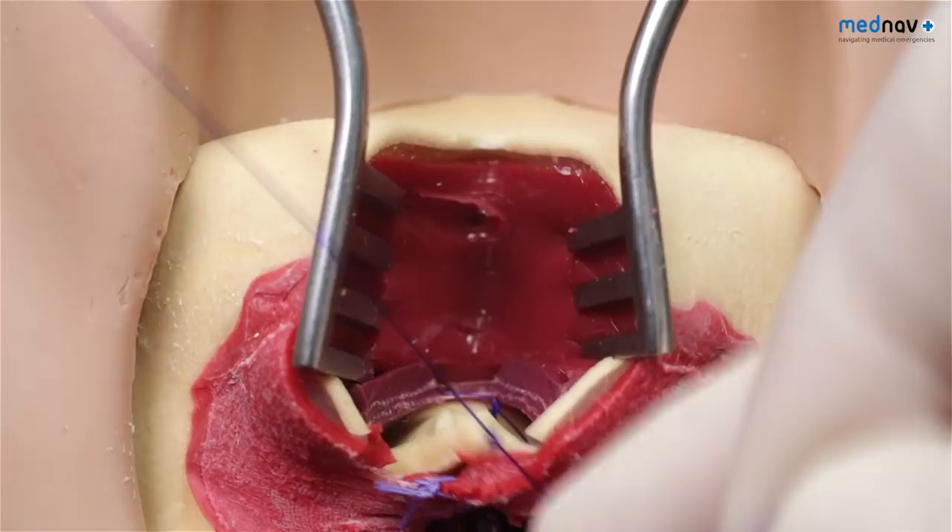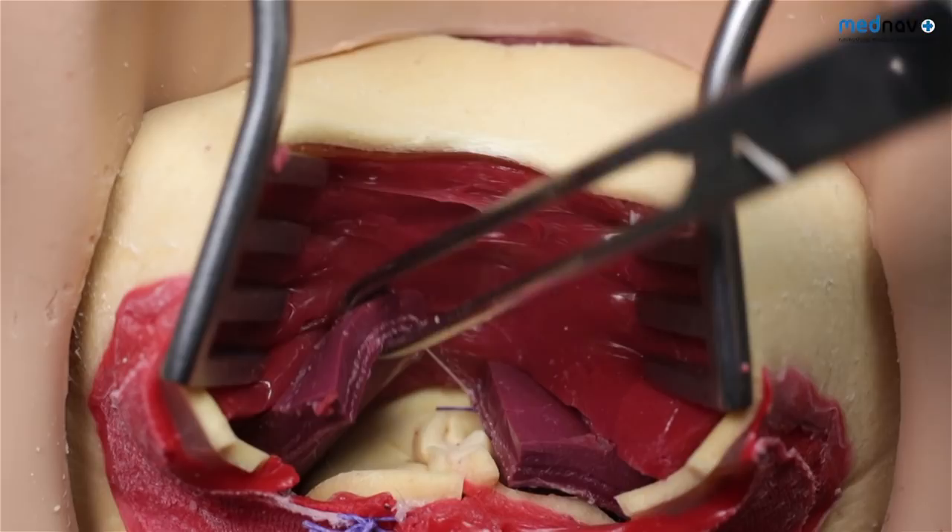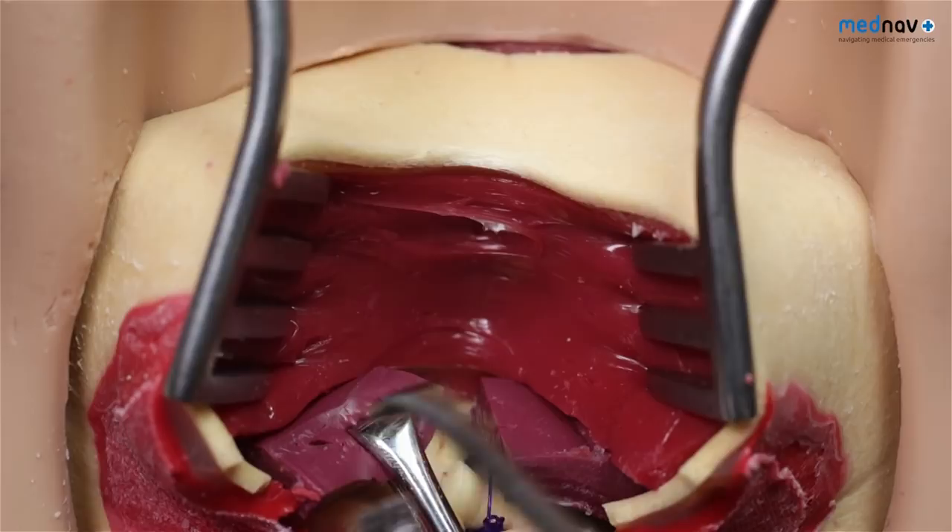The external anal sphincter can be identified as a thick fleshy red structure. Once identified, place Alice forceps to either edge.